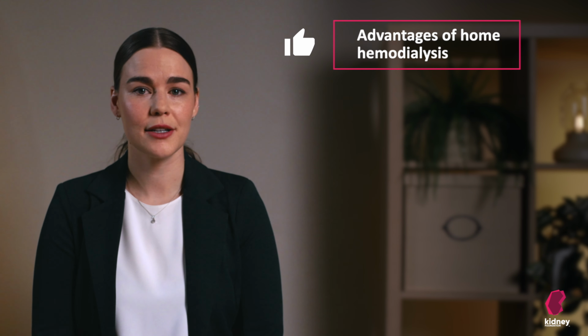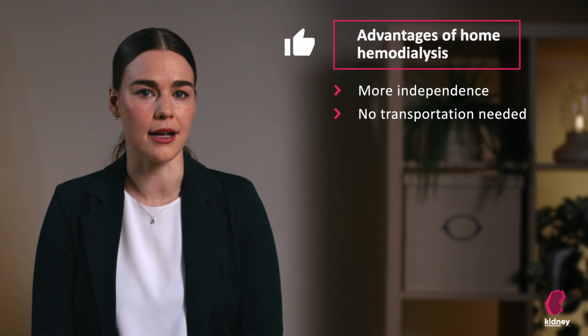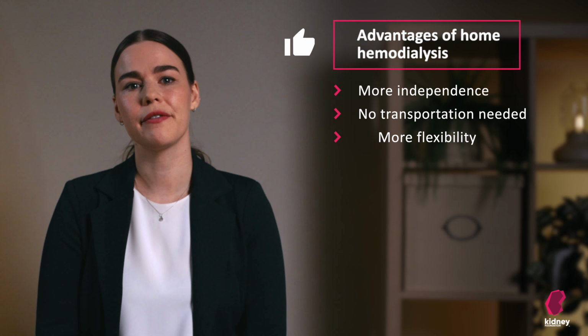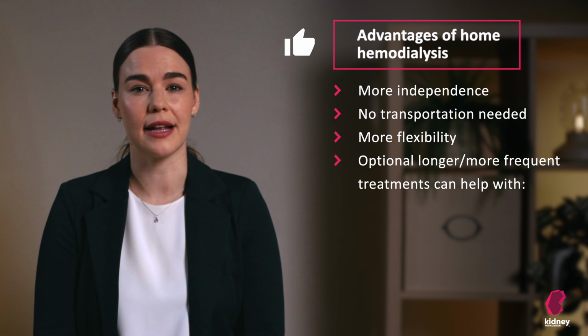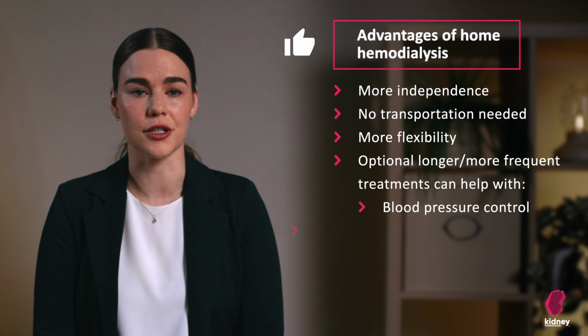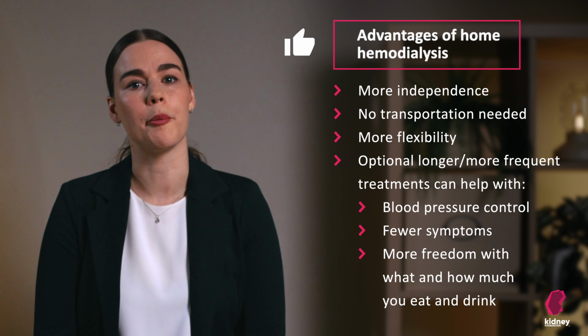Here are some advantages of home hemodialysis. When you do dialysis at home, you have more independence and you don't need transportation to get to the dialysis unit. With home hemodialysis, you have the flexibility of doing more frequent or longer treatments, for example, during the night. There are many advantages to this, including better blood pressure control with fewer medications, fewer symptoms, and more freedom in what and how much you eat and drink.